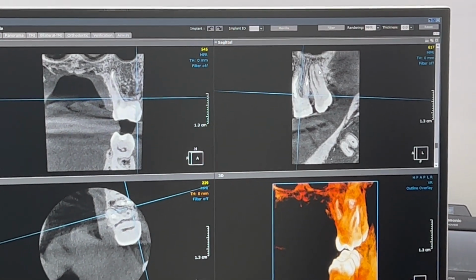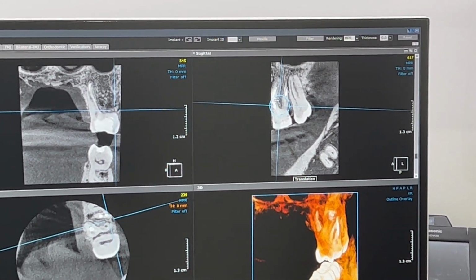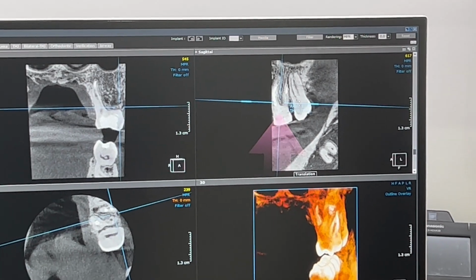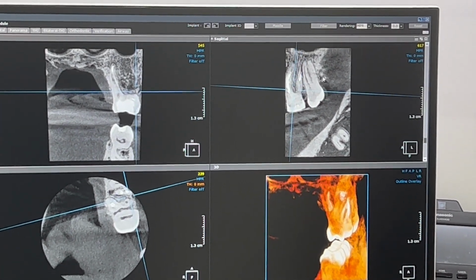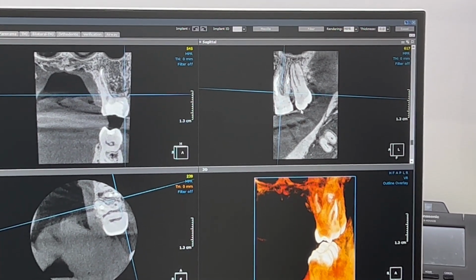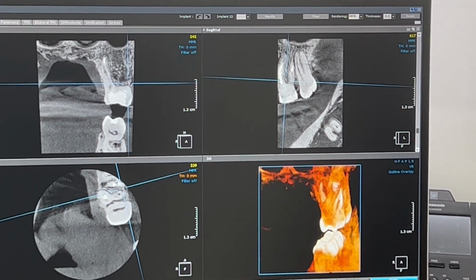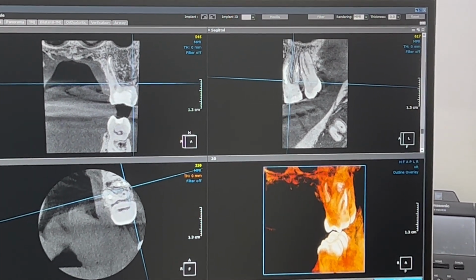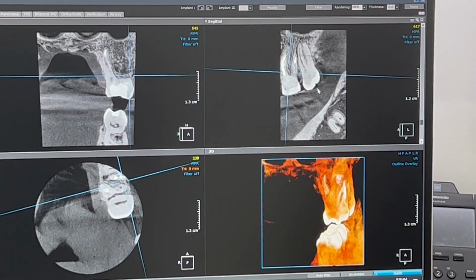So basically we got the patient and the dentist in, we took a CT scan, their colleagues and friends, and what that found is just off a quick CT scan, just 2 teeth in that CT, you could see that it wasn't actually a case of anything to do with the root canal or anything missed. The dentist had done a great job. It was actually resorption, external resorption on the distobuccal root, and that got picked up quite well there on CT scans.